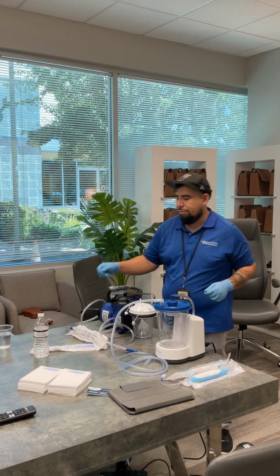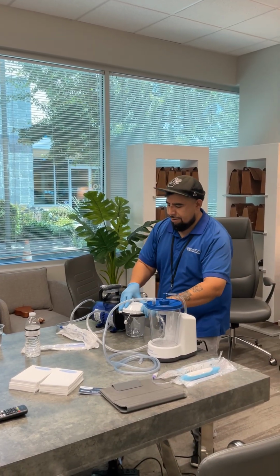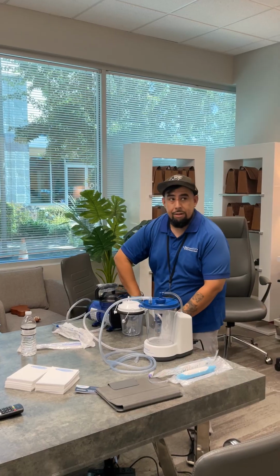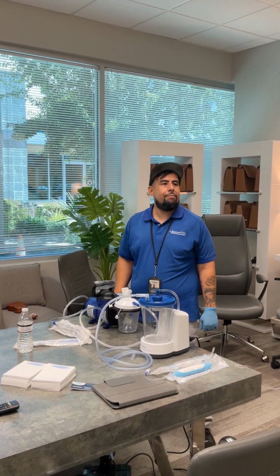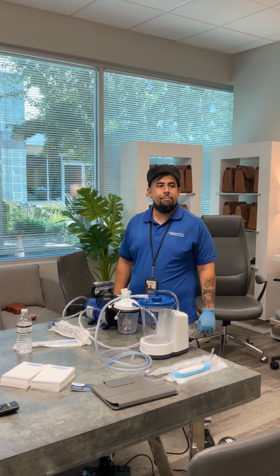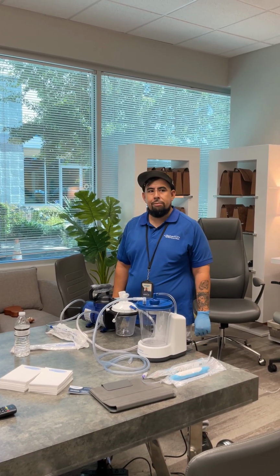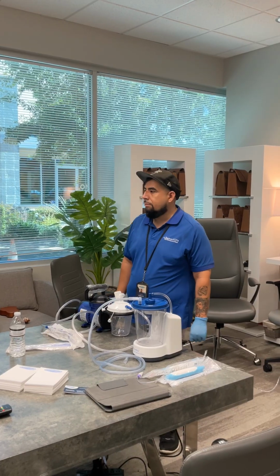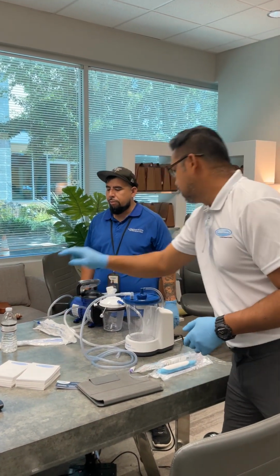And cleaning, you know, warm soapy water. Like you said, having a little bit of water in there helps it not stick. But if it gets a buildup of odor and bacteria growth, you can use a little bit of white vinegar to keep bacteria down. So you only give one of those canisters when you supply? One canister and 2 of these ones.